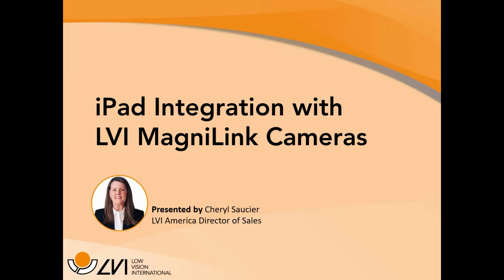Today's webinar is entitled iPad Integration with LVI Magnilink Cameras. The real goal today is not to go into a lot of depth about any one of our products that connect with iPads, or about our Magnilink Viewer app, but really to give you an overview of all of the different products that we have that can connect to iPads and all the different ways you might be able to do that.